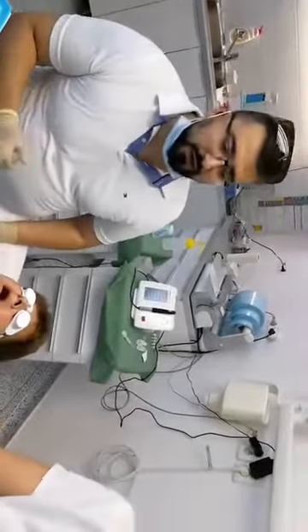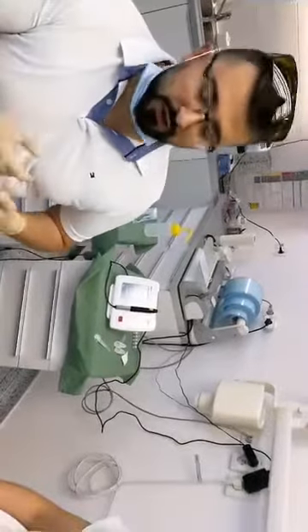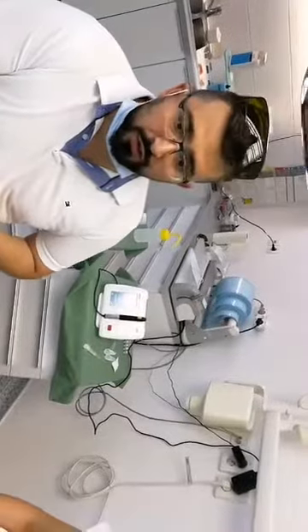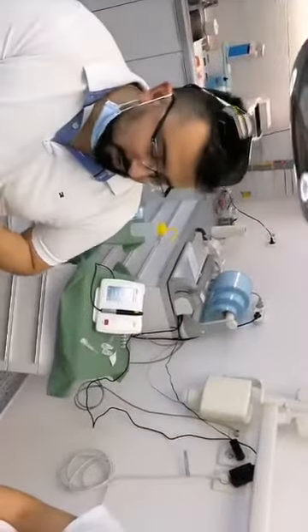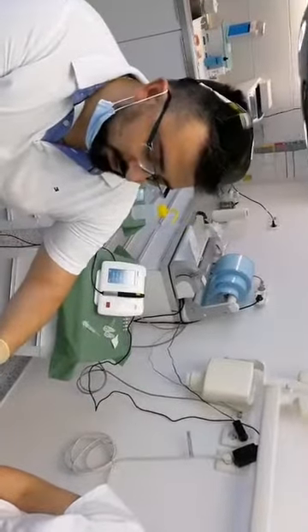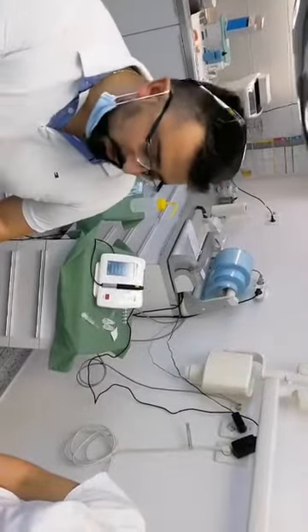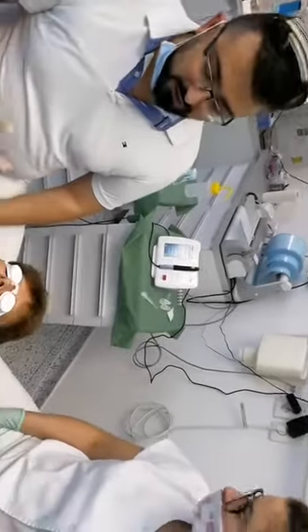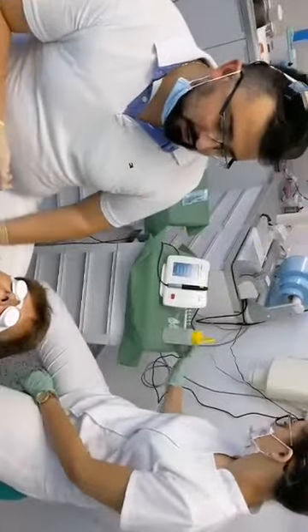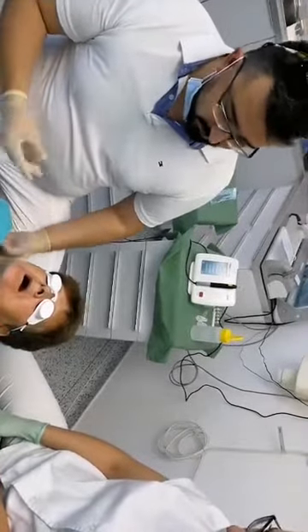During the surgery we need to use suction because of the vaporized tissue, so there is no bad smell. We will also do the cooling of the tissue with plain water, because the heat accumulates and it's going to be too hot if we do not use any cooling. You don't need to use any special coolant — plain water works because the laser is not only cutting but it's also killing everything in the area of surgery, so there is no trouble with any kind of infection.